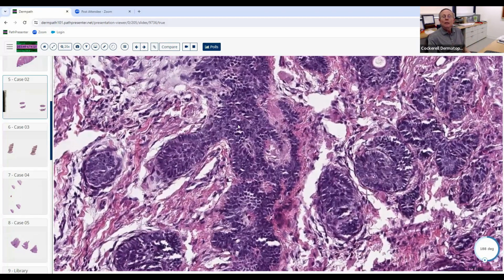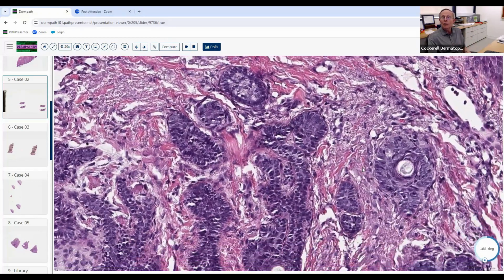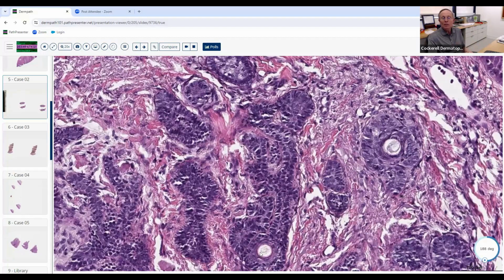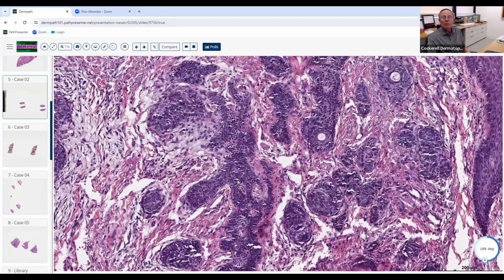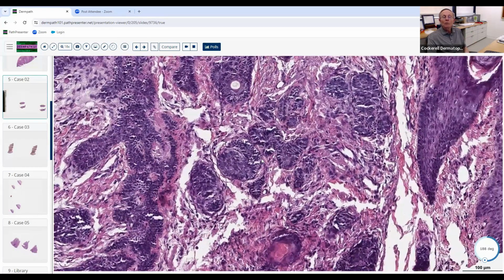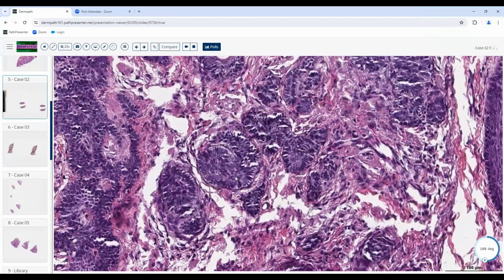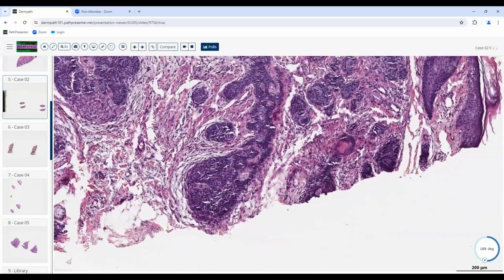Okay, good. What else allowed you to favor the diagnosis of non-basal cell? So you get the little cysts. Sometimes you can see that, but less common. The lack of clefting between the epithelium and the stroma, and the lack of the fibromucinous stroma, that's helpful. Anything else that helps you? Perhaps cellular atypia and things which you shouldn't really see in the trichoepithelioma.